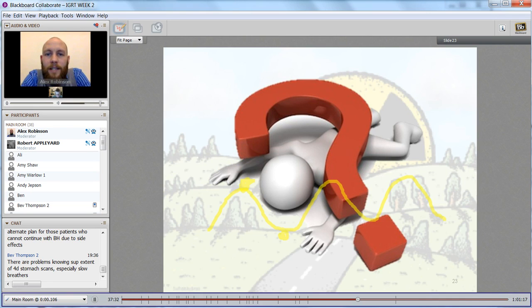The easiest way for us to consider this is if we consider a normal CT scan to start with. On the CT scan, the easiest way to look at it is the diaphragm or the heart. As it goes through, you get this artifact of motion, a bit like an old school camera where you take a picture, and if the shutter speed was really slow, you get this blurred image.